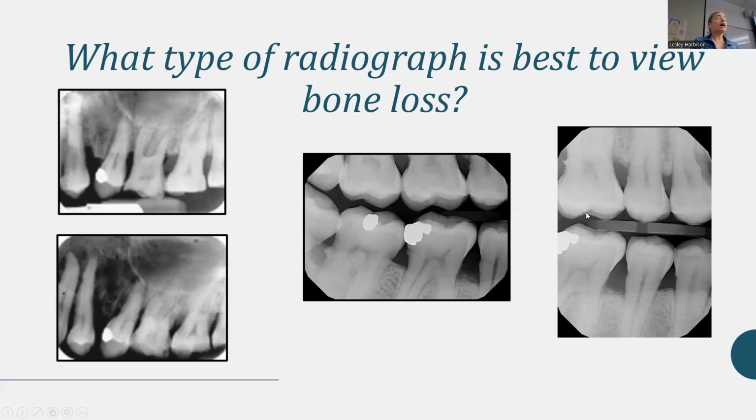And it's not like it's their fault. They don't have that repetitive experience. So one of the first things that you need to ask yourself when you have a patient and you've realized their perio is, what kind of x-ray should I take? And then go back and look, like, what did they take before? And even if they took horizontal x-rays, you can override that and be like, they took horizontal, but you can't see the bone level. So I'm going to take vertical, because that's what a clinician who's critically thinking would do.